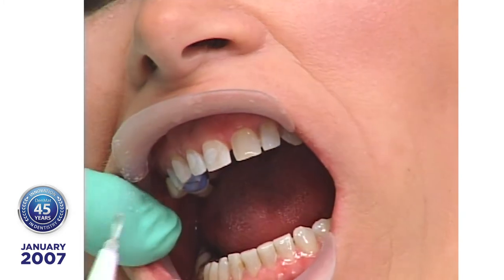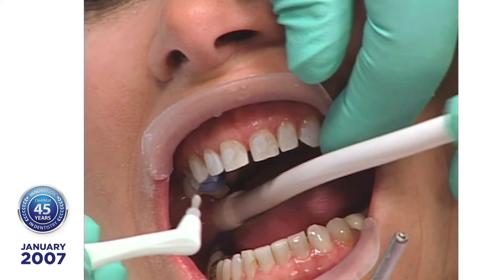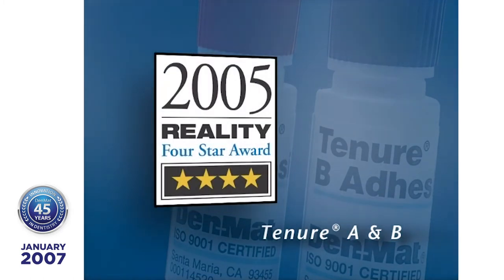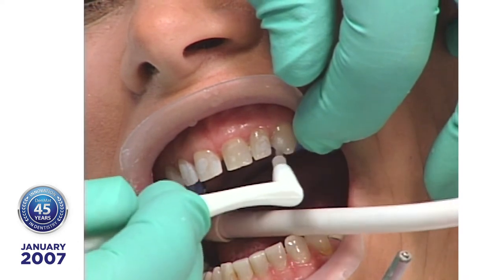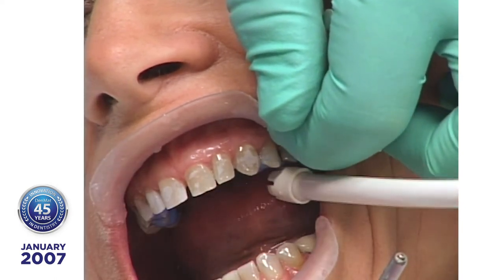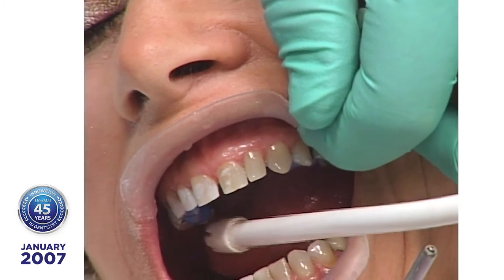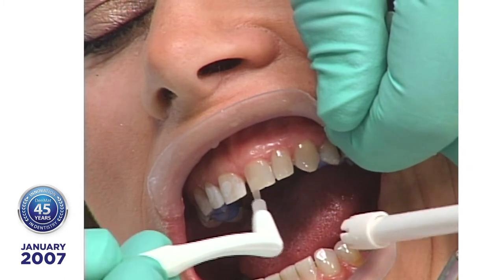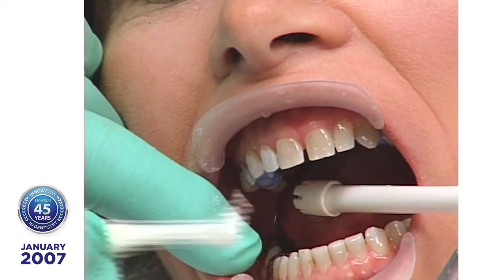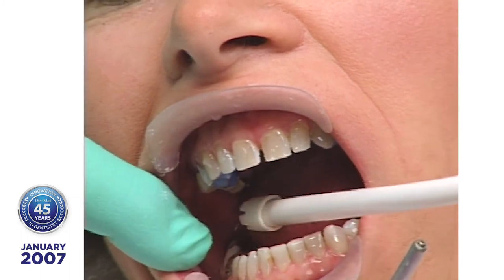Now we're putting Serenate Prime on our teeth, then Tenure AB. Tenure AB was developed by Ray Bowen, who developed composites and the concept of the air rotor. He came up to me at the ADA meeting in Atlanta and said he had a fantastic dentin bonding agent but it had nine steps and he couldn't get anybody to use it. So he licensed it to us, we got it down to two steps and finally two solutions you mix together — just apply one. We've been working with it for over 20 years. New and improved products don't always bond to everything or they're light dependent, but Tenure works and you don't need a light to make it effective.